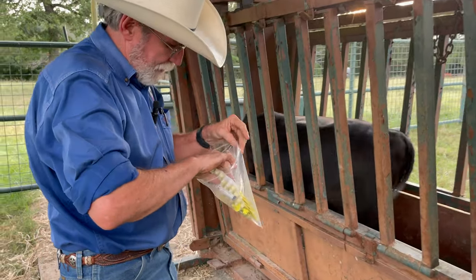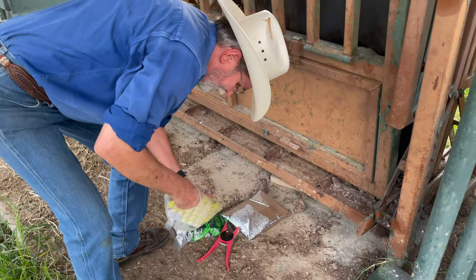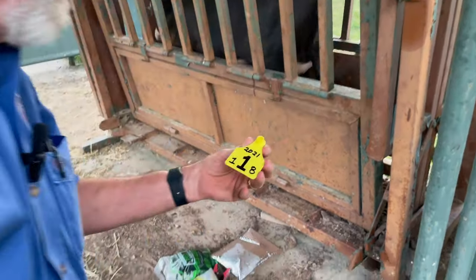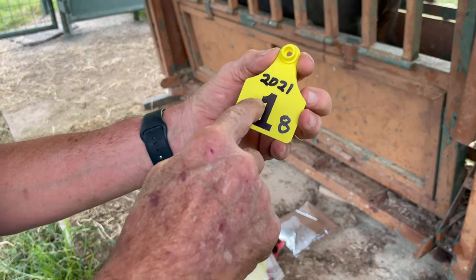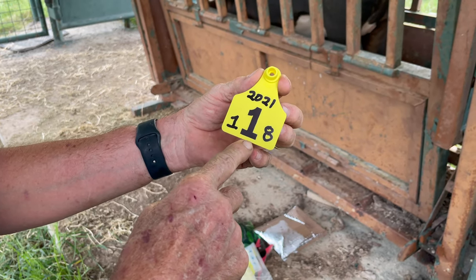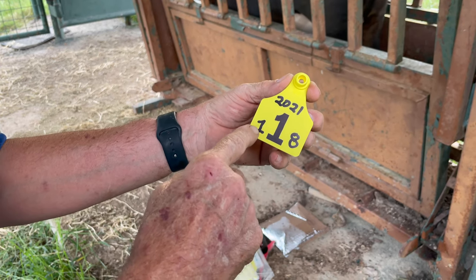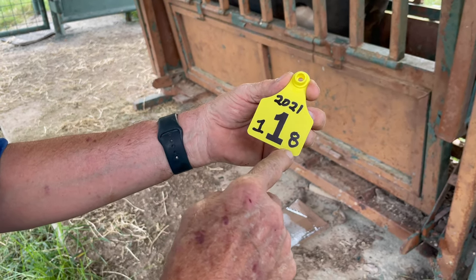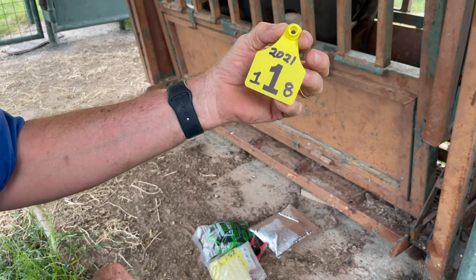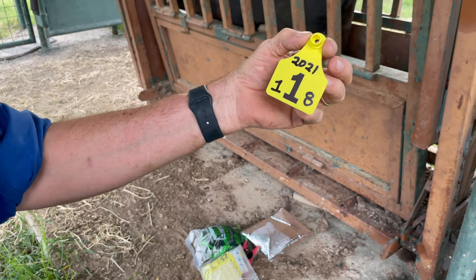This one I'm just going to tag. I've marked this tag — it's pre-printed with the number one. This is going to be my heifers I keep this year. She was born in 2021 and she's out of cow number 18, so I can track her mom. Probably a lot better ways to identify them, but that's the one I'm going to use for right now, and we'll progress through the year.